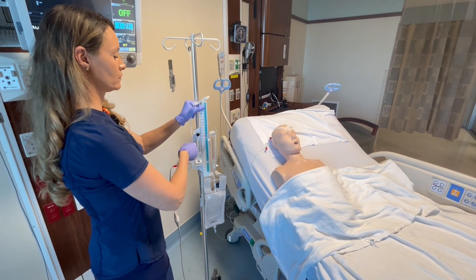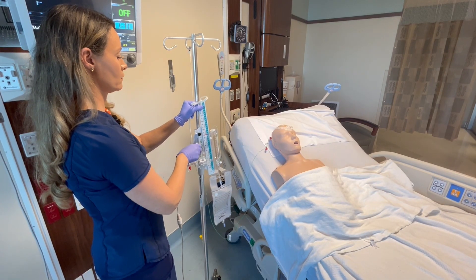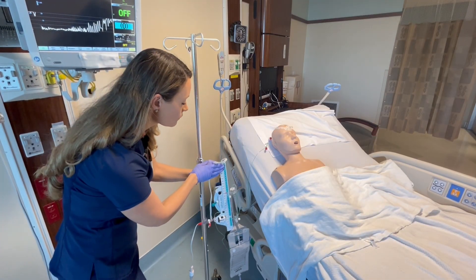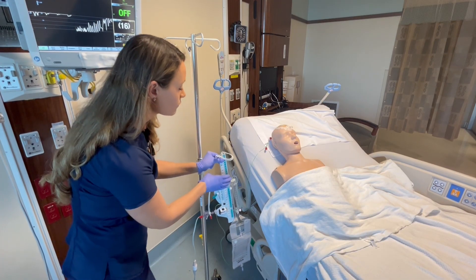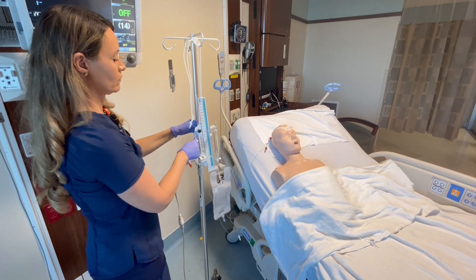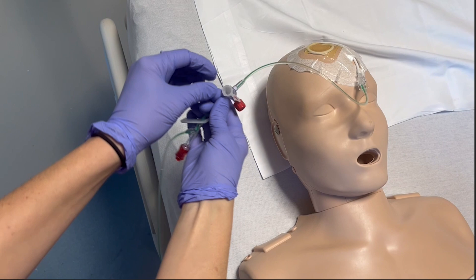Troubleshooting: if the EVD stops draining, it could be because the true ICP is lower than what the EVD is set to drain at, or it could be clotted off. One technique to assess if the drain has clotted off is to take the EVD off the IV pole and lower it well below the insertion point. If the EVD is still not draining after this, it is either clotted off or a stopcock is closed. If a stopcock is not closed, assume a clog of some sort and notify the provider immediately.